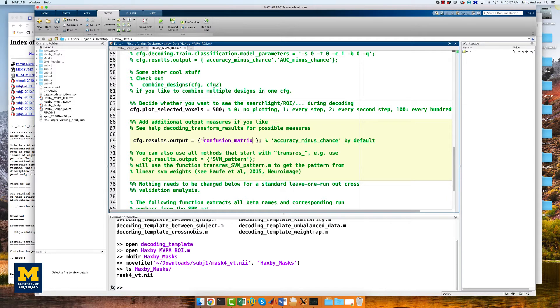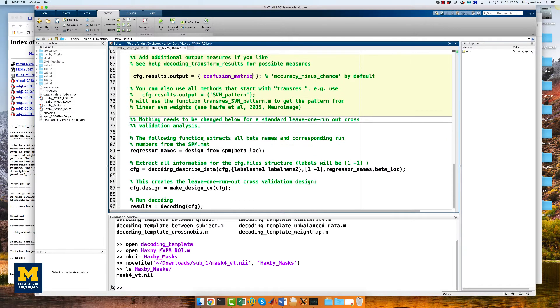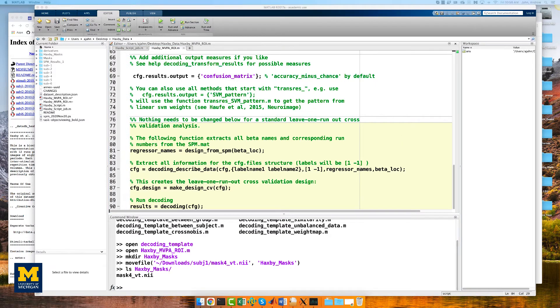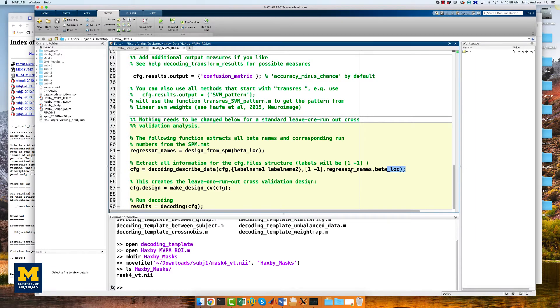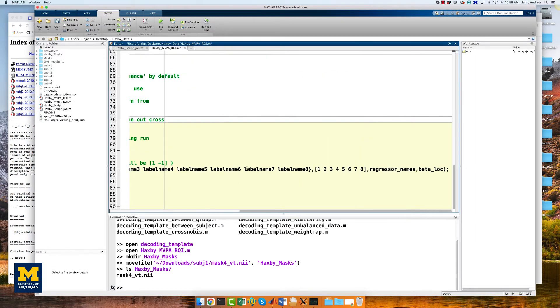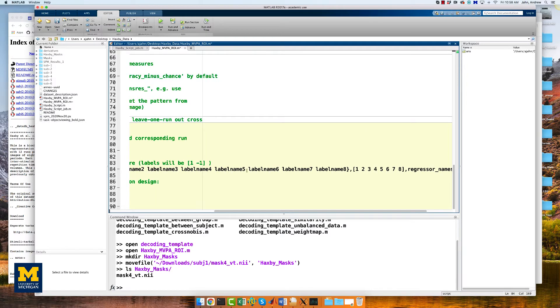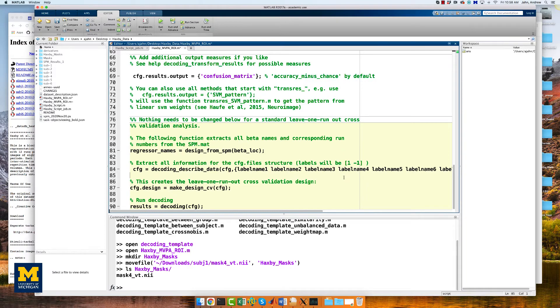The last line to edit is near the end, starting with config equals decoding_describe_data. This contains only two conditions by default. To expand it to our eight conditions, replace it with the line of code provided in the More Info box below. The only change is expanding it from label_names 1 and 2 all the way through label_name 8, and creating a vector containing the numbers one through eight.